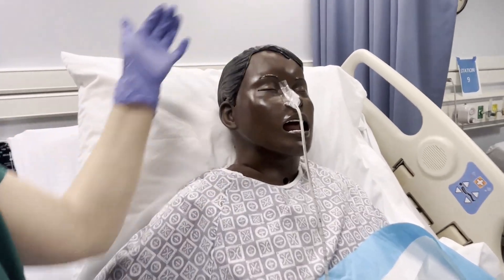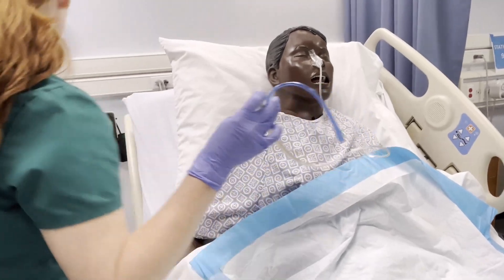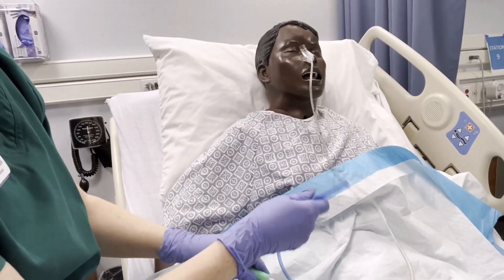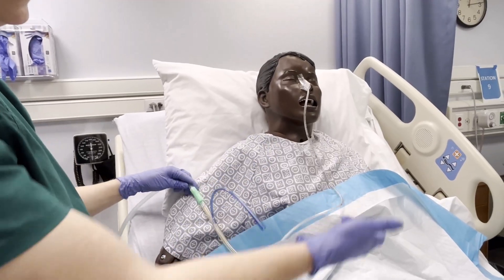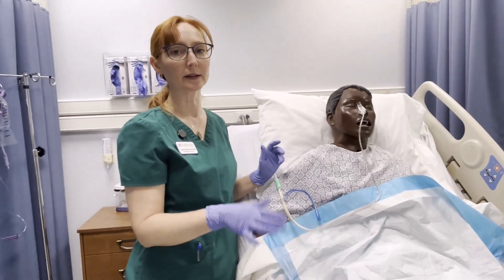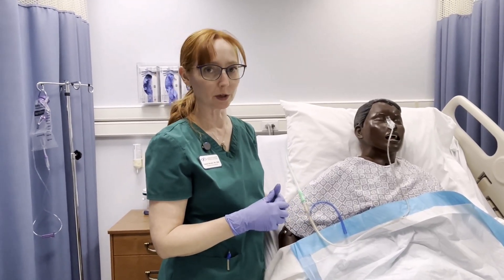That's how you do that procedure. This would then connect to suction — to the canister — and it usually has a little white and blue end piece. The stomach contents will come out. When it's a new obstruction, it's usually very dark brown. As the stomach and intestines start working again, it lightens up in color, so you should generally see that progression.